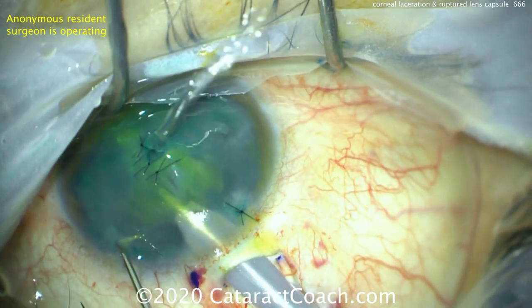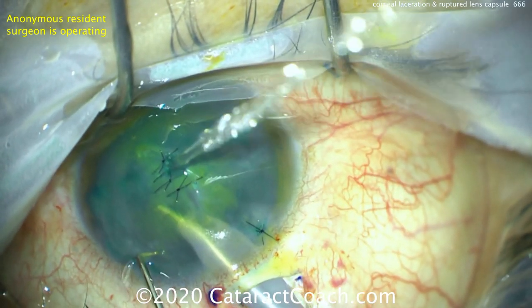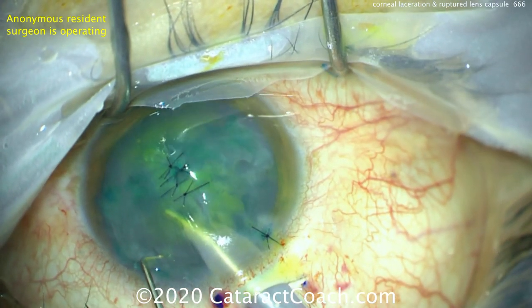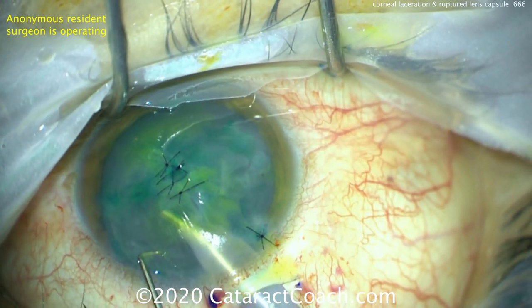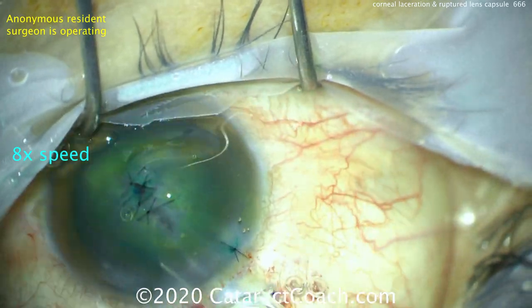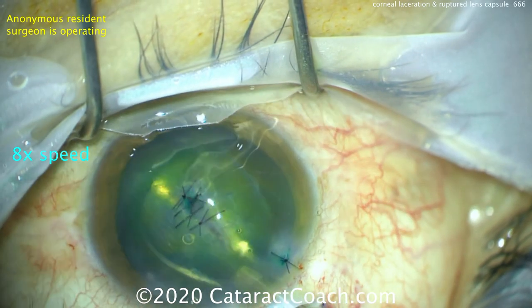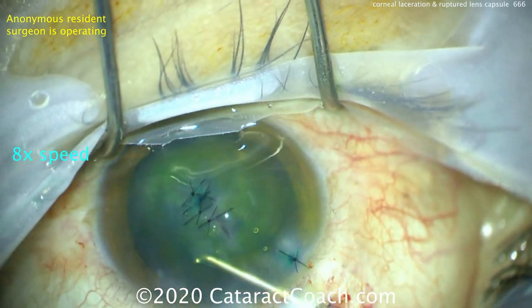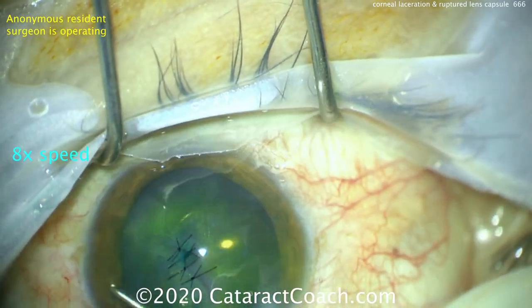Intraoperatively, we want general anesthesia. Look at that leak from the central cornea — stop right now and put a suture in. You've got to close that central cornea; you can't operate with such terrible fluidics. Take pictures of the eye in the pre-op period — very important. Place a patient ID sticker on the eye as you take pictures, so you can easily identify the eye and the patient.